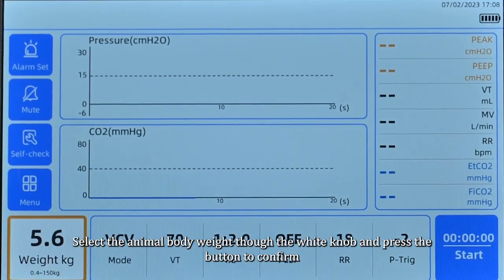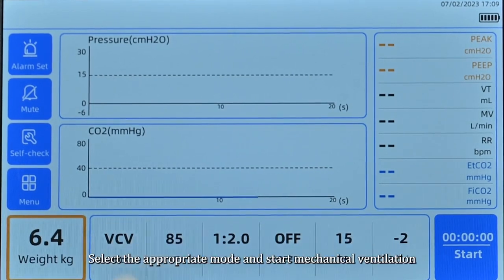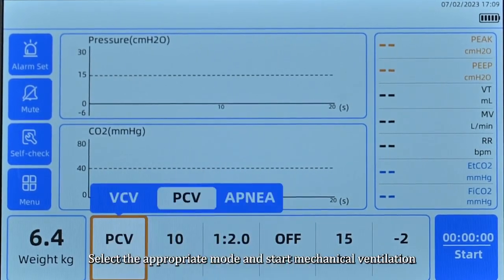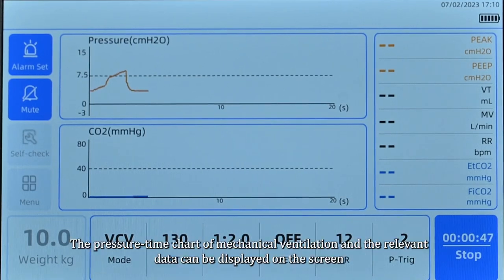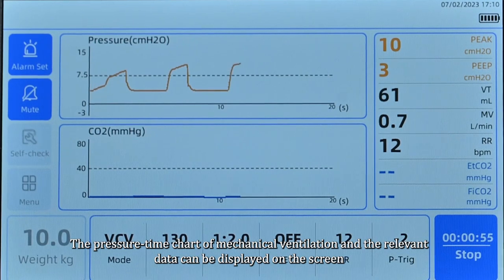Select the animal body weight using the white knob and press the button to confirm. Select the appropriate ventilation mode and start mechanical ventilation. The pressure-time chart of mechanical ventilation and the relevant data can be displayed on the screen.